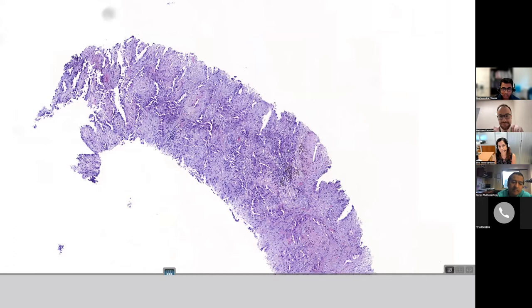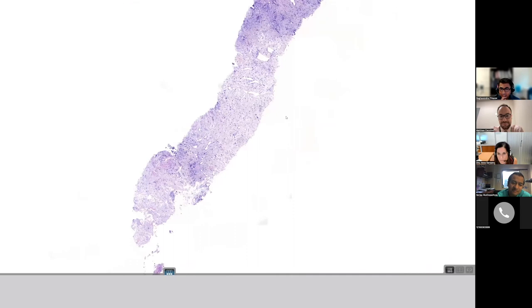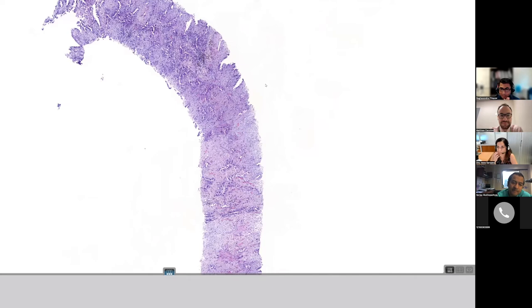And also, I would find it very difficult to mark this slide exactly where they want to capture the glands when they're taking... You have to put the whole thing in this case. Exactly. So when we are including the whole thing, you're including so much non-neoplastic nuclei, especially the lymphocytes and the stromal cells. So I'm more conservative on this. The tumor purity, I think I would say 30 to 40. Maybe 35, 40. Again, it's subjective, like Sanjay was mentioning.